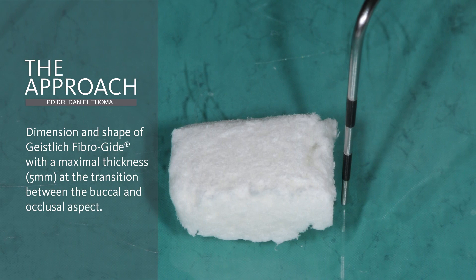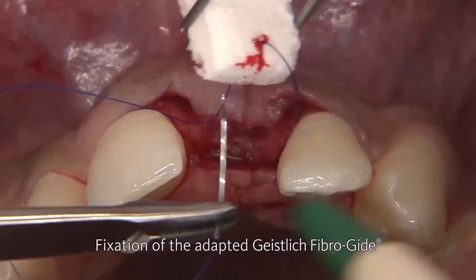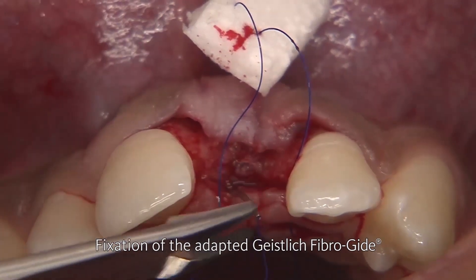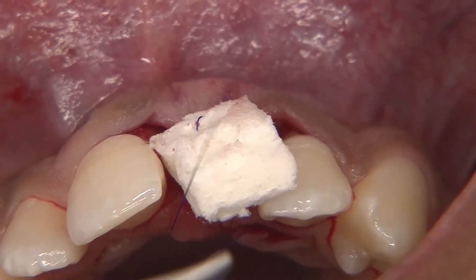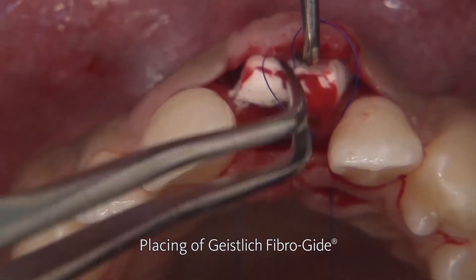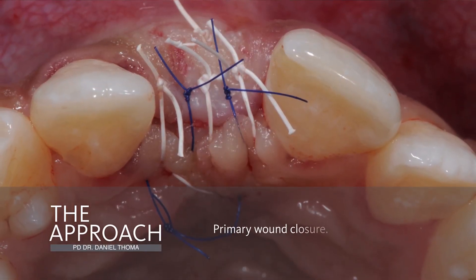Subsequently, the Fibroguide is shaped to match the desired defect site, and thereafter the Fibroguide is sutured using a horizontal mattress suture towards the palatal aspect. The entire matrix is subsequently placed on the buccal side, inserting it into the pouch. Following the placement and initial suturing with the horizontal mattress suture towards the palatal aspect, primary wound closure is obtained.